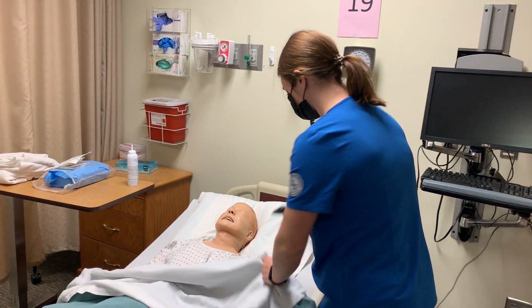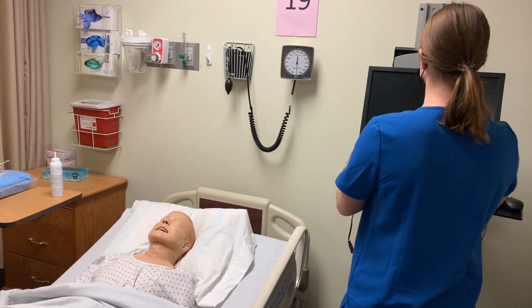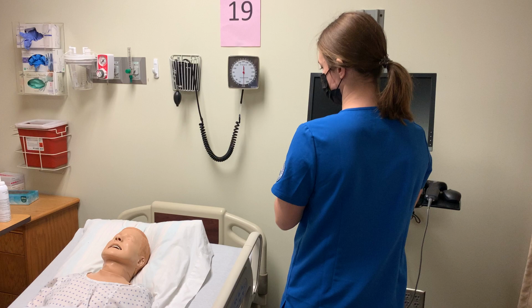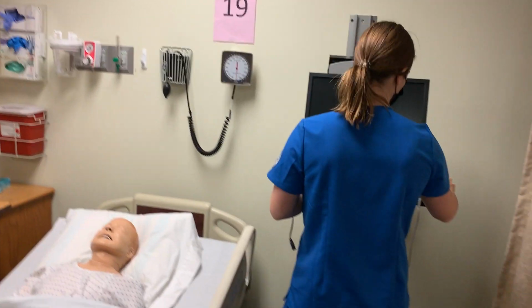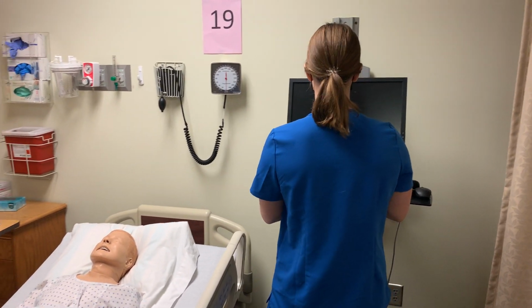So I'm scanning your wristband. Can you please tell me your name and your date of birth? Alexa Ellingheisen, August 29, 2000. Perfect, Alexa. Do you have any allergies? I don't. Okay. Do you have any allergies specifically to latex or iodine? I don't. Okay.